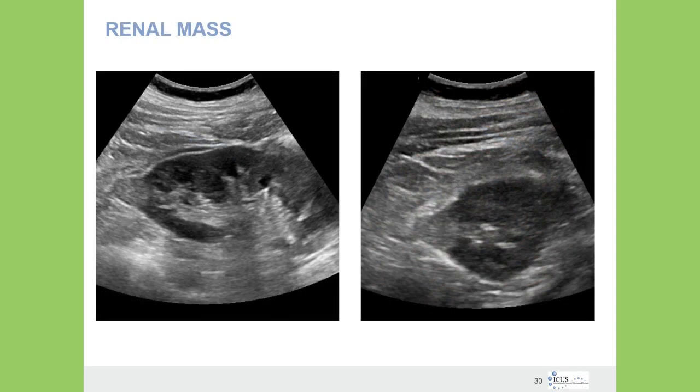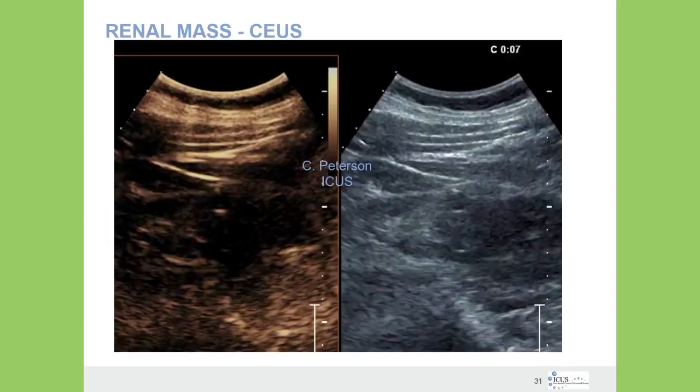This is a patient who had a renal mass noted at the superior lateral aspect of the kidney on a CT that was performed without contrast due to the suspicion of kidney stones. There was a slight contour defect in this kidney, and the patient was sent in for contrast imaging. So based on what we have discussed so far, let's take a look at a contrast injection in this patient.